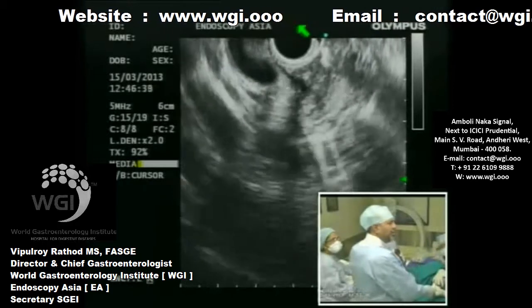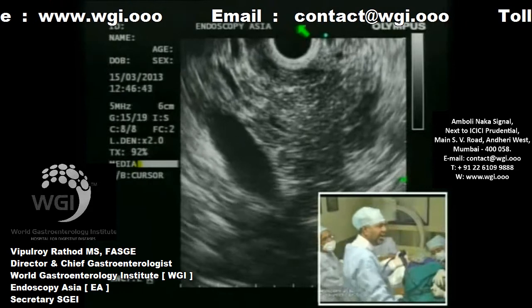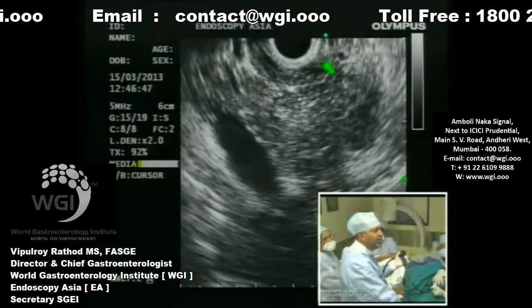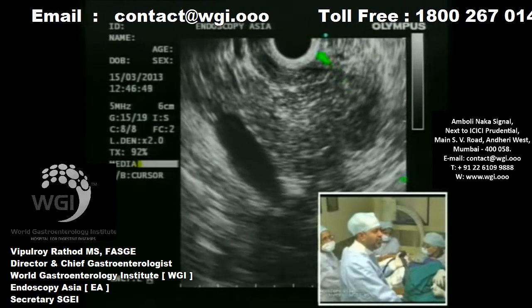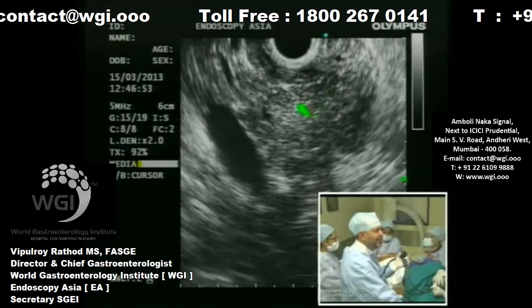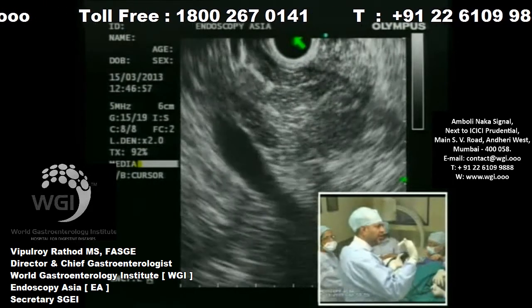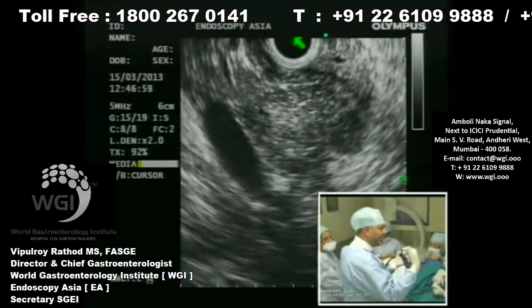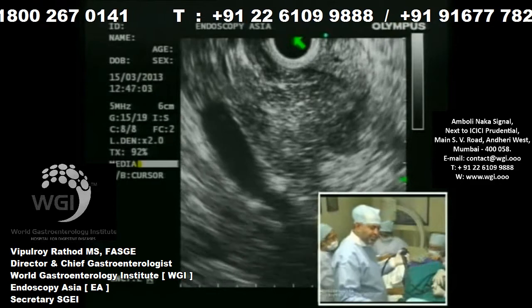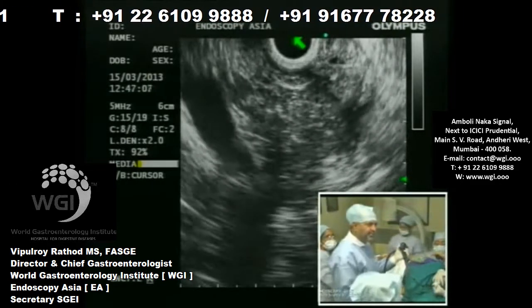You see the gallbladder part, and this is the pancreatic head part. So this is the area I'm going to take an FNA-B with a 22 gauge needle now. Whenever there is a pancreatic head area, I prefer to use a 22 gauge needle. It gives you a good curvature in the duodenum, and I feel that this particular approach is much more suited for difficult situations such as this.